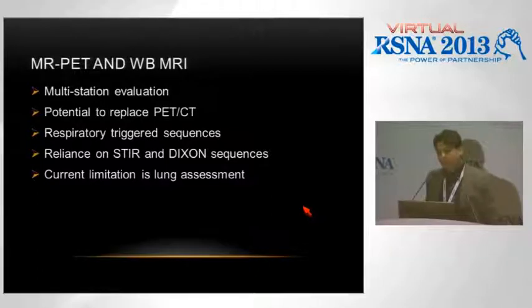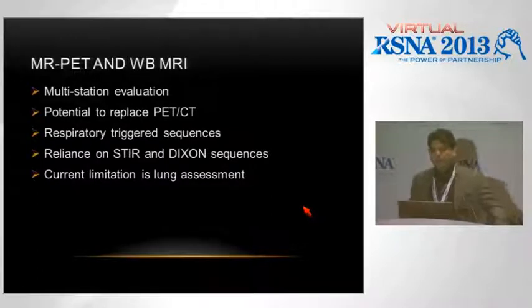I'm going to shift gears and go on to a little bit on MR PET with whole body MR. This is a very, very robust technique that has come to the fore. It's fairly recent. We've been very fortunate to acquire a whole MR PET system a few months ago, and yet we've been using it predominantly for lymphoma. But yes, we're trying to look into more and more indications to do MR PET to see if we can find an alternative to PET CT because of the radiation aspects associated with it.